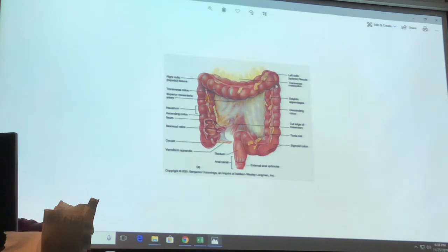This is the large intestine. The function of the large intestine is twofold. One, it is water reclamation. So it's very important to reclaiming water from digestion. And as kind of a side benefit there, it also reclaims a lot of the water-soluble vitamins that are in our system. And then it's the elimination of solid waste. Okay? So as we look at just the general structure, we refer to these as the colon.